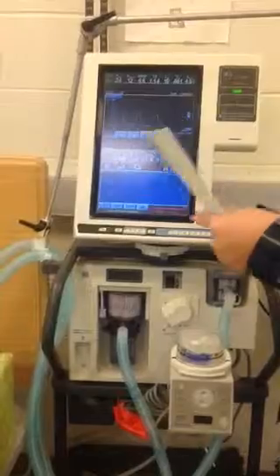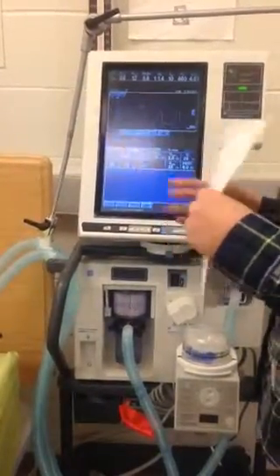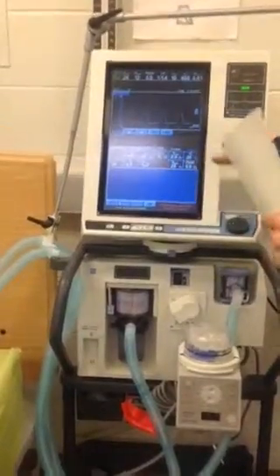and accept. Of course, with this lung, it's not going to have any spontaneous respirations, and we'll kick into our SIMV backup mode. 30 minutes after initiating the spontaneous breathing trial, I obtain an ABG and weaning parameters.